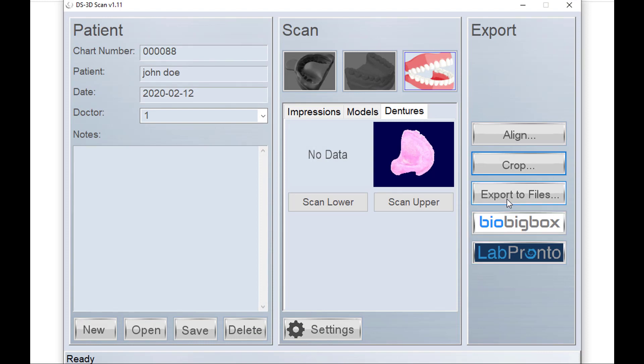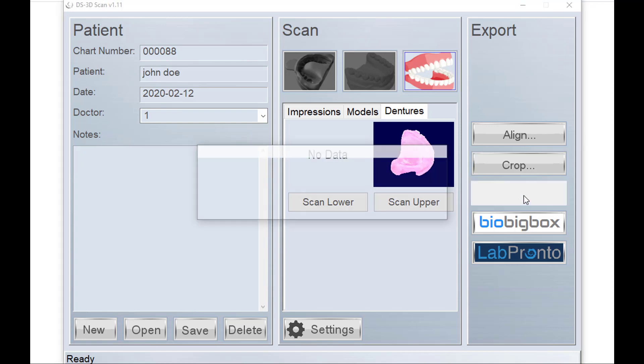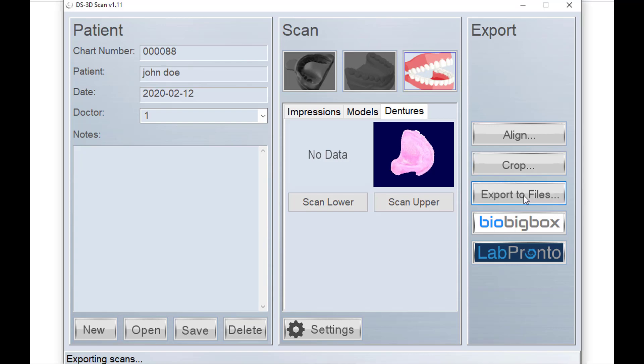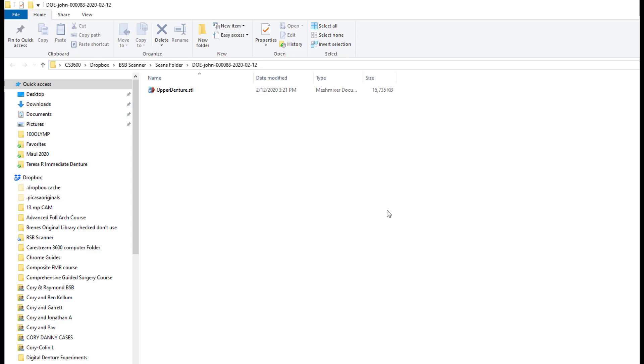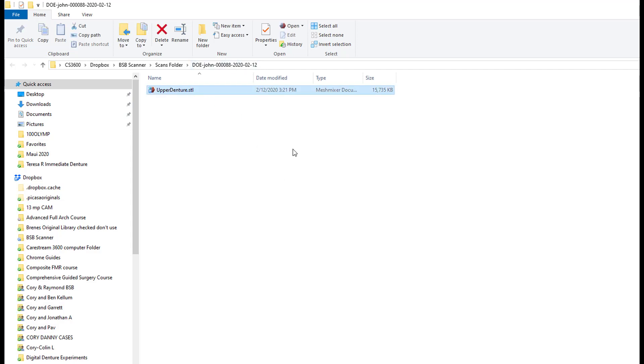And finally, we can now export the file. So if you wanted to get your actual duplicate denture STL, we could now go to export to files. And here you see it opens a folder and it has one file in it called upper denture.